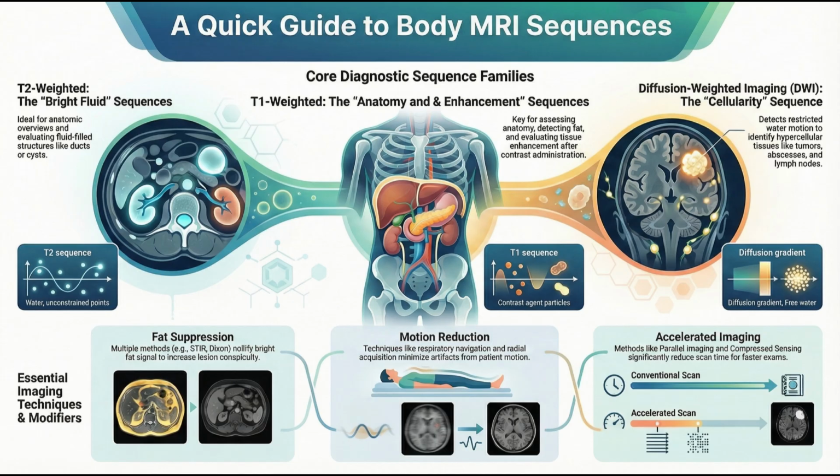What a fantastic journey. We started with what feels like this daunting, endless list of acronyms, and we've pulled it all together into a strategic framework. It's about speed, composition, and function. It is. And the key takeaway for you, I think, is that understanding the purpose, the why behind what you're doing, is so much more valuable than just memorizing every acronym. That is exactly right. If parallel imaging lets us scan faster and high-res sequences let us see tumors that are only 2mm deep, we've really established a new foundation.